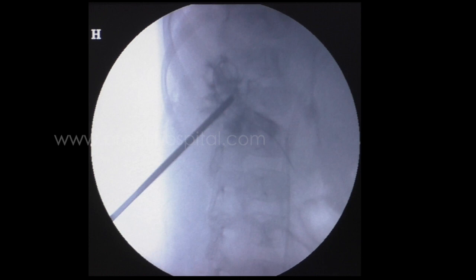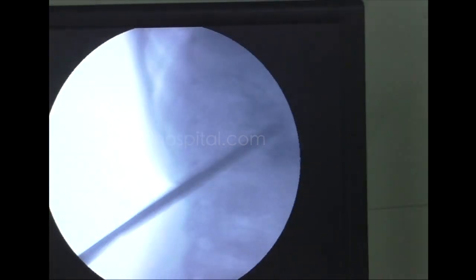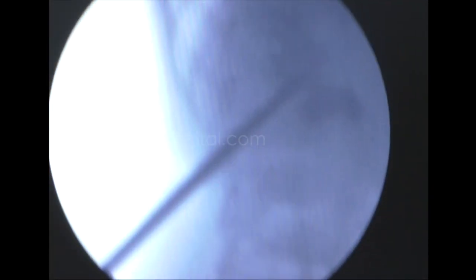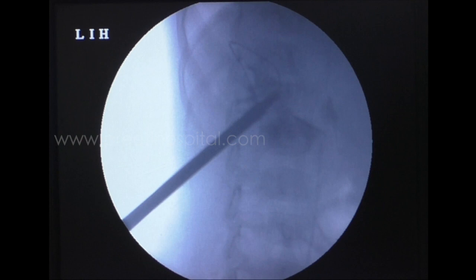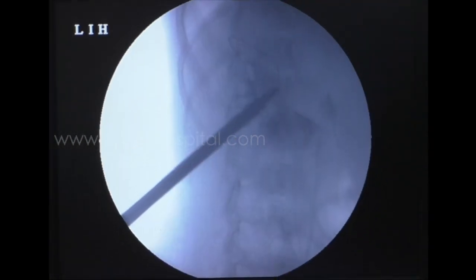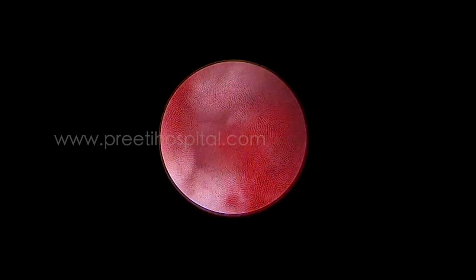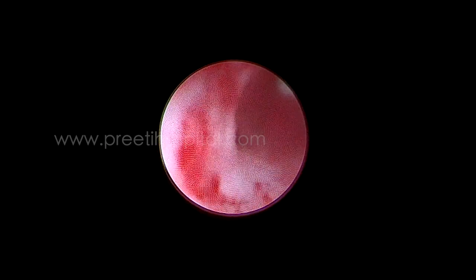The kidney is moving almost to the opposite side of the spine, even with minimal dilatation. In supine PCNL, the movement of the kidney is more pronounced, and sometimes it goes so medial that perforation can occur. In fact, in this case we observed opposite-side perforation of the tract. This small perforation is the major problem we want to highlight.